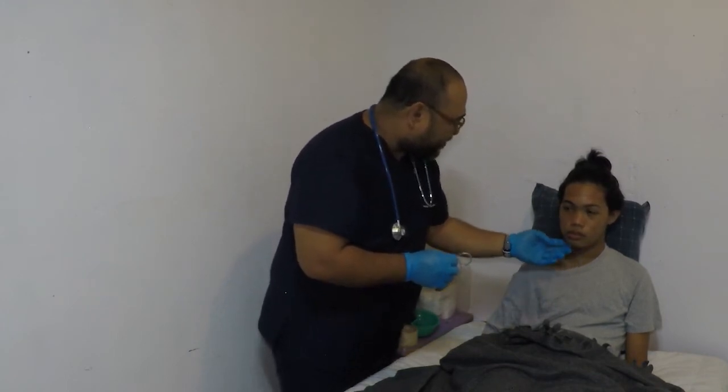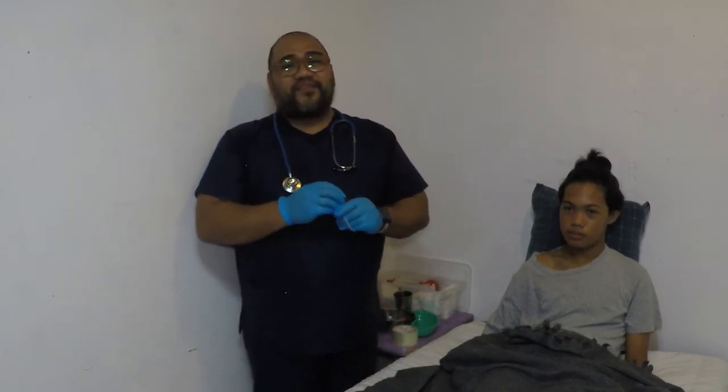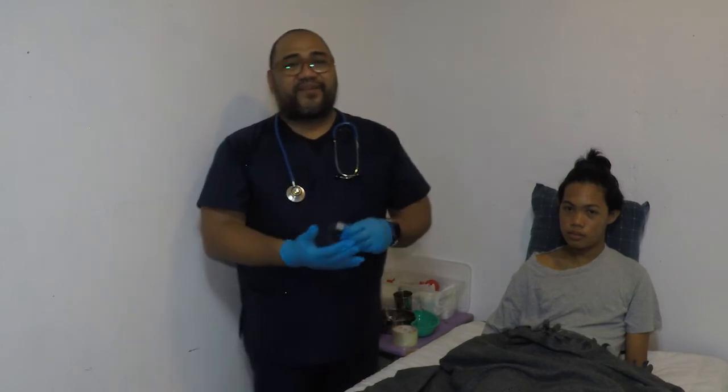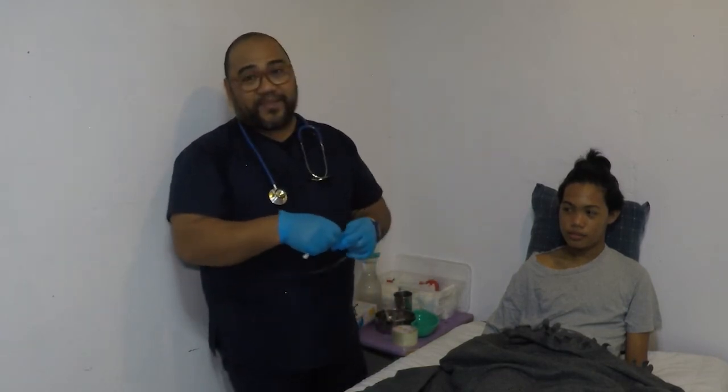So feeling better, sir? You're good? You're full? So you have to take note. Do not remove the tube if you encounter any resistance, so as not to harm any membranes or organs. Do not make another attempt for an hour. Continuous slow pulling out can lead to coughing or discomfort. So I'll be repeating the procedure.